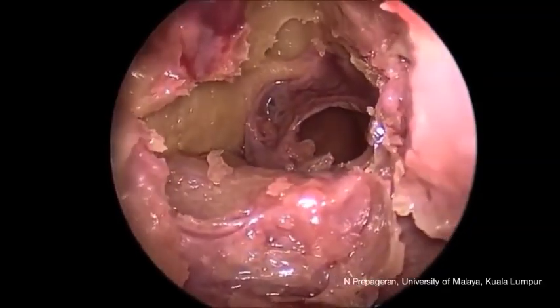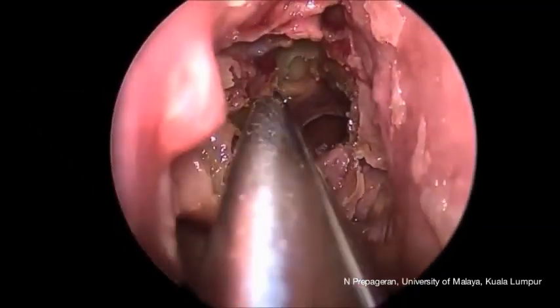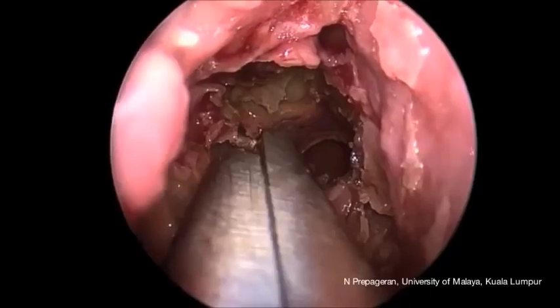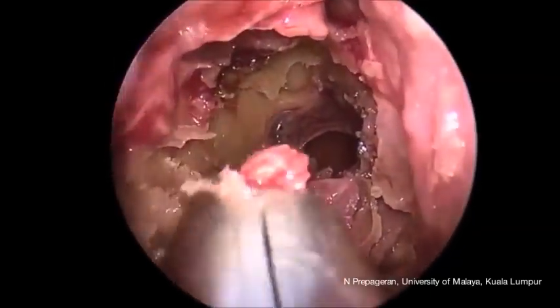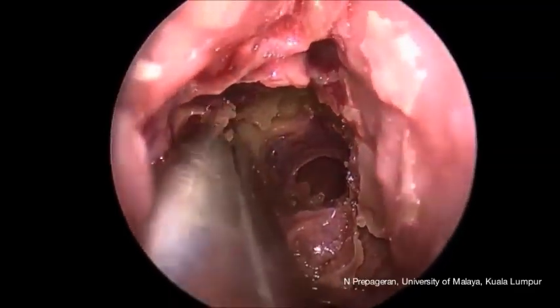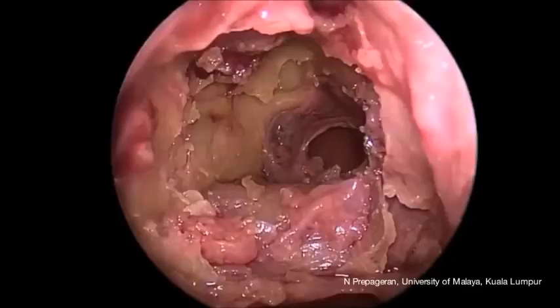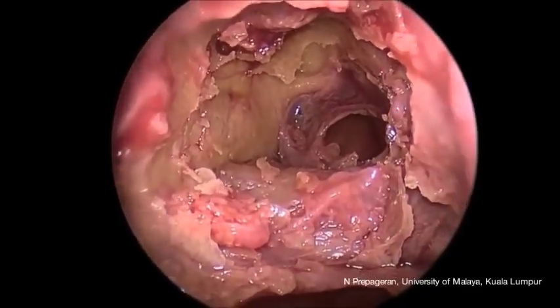And right posteriorly is a very nice view of the posterior ethmoidal artery, just anterior to the anterior wall of the sphenoid, transethmoidally, which is gate number 4. We are now removing all the ledges laterally, and that gives us a very nice view of the lamina papyracea itself, which forms the lateral border of the ethmoids. So this is how the lamina papyracea is exposed. That's a very nice view of the lamina papyracea and the posterior ethmoidal artery.